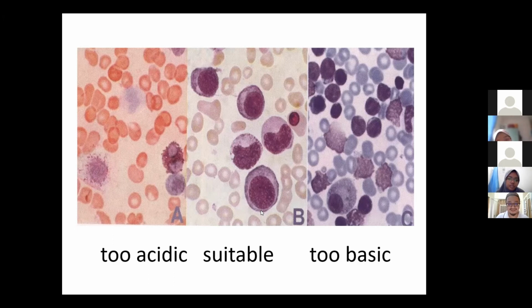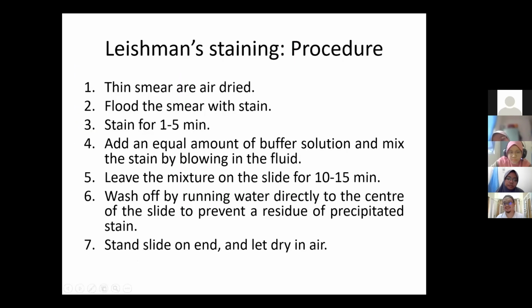Saya tengah cakap pasal thin smear. Okay, so when we perform the smear, the blood will still be fresh, kan? Dia tak coagulate lagi, dia tak clot lagi, kan? So we need to wait until the blood is dry, yeah? And we don't want to put it next to a fan, for example, to dry, or put it on a heater.